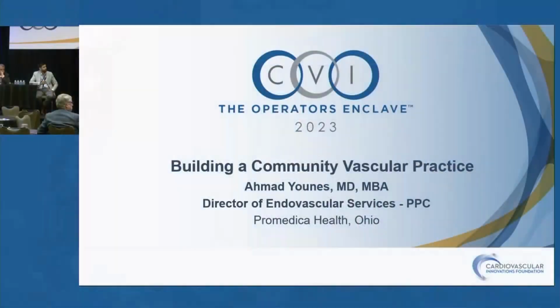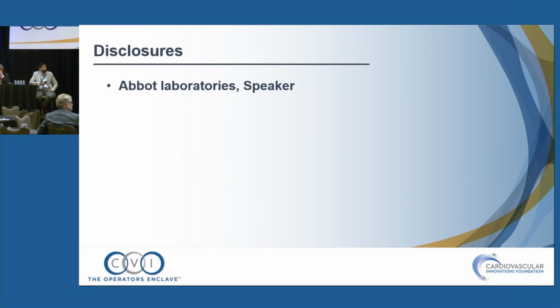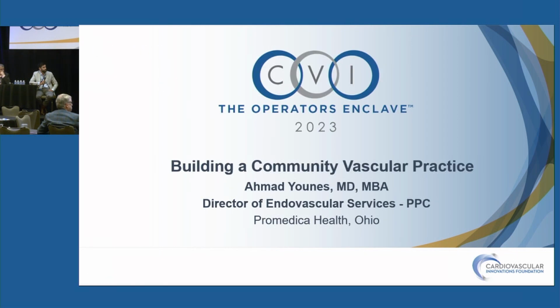Yes, thank you so much. I agree. Sometimes a primary cut down is so much easier than having to go back to fix it after it's a hematoma or thrombosed. It's good for mental health because you don't worry about it. It's also good for the operator's mental health.